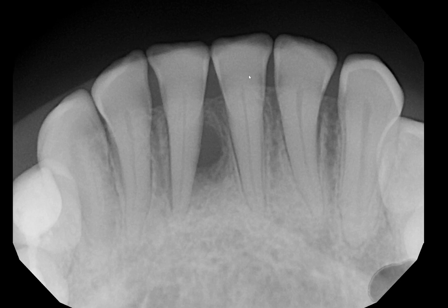Hello class, this is Dr. Kim. When you look at this periapical radiograph, I hope you find something interesting besides this radiolucency between the mandibular central incisors, and that I'm in this radiolucency.